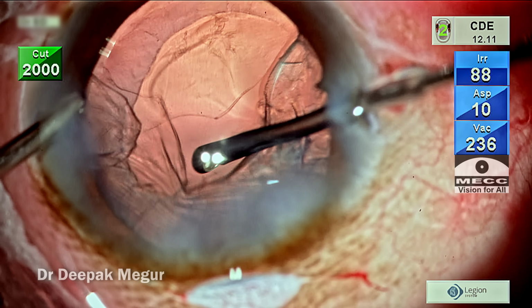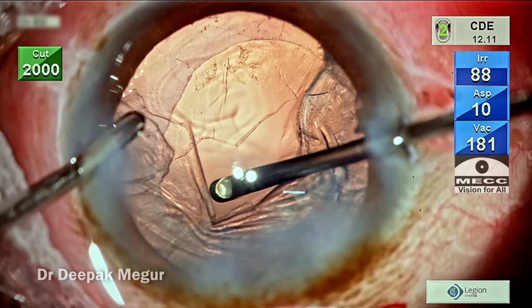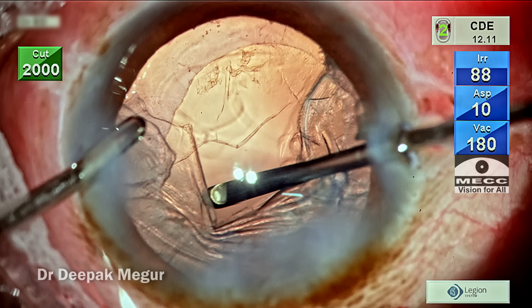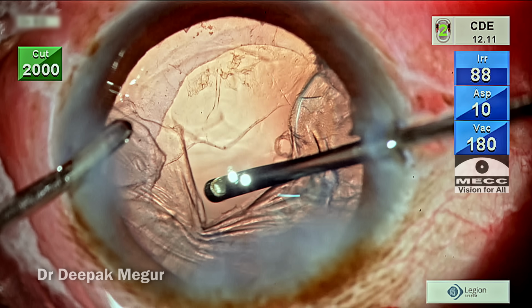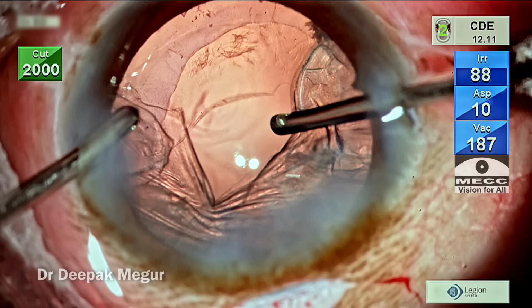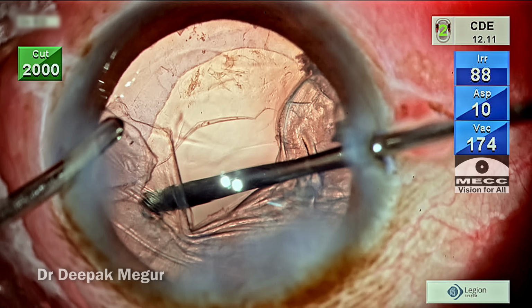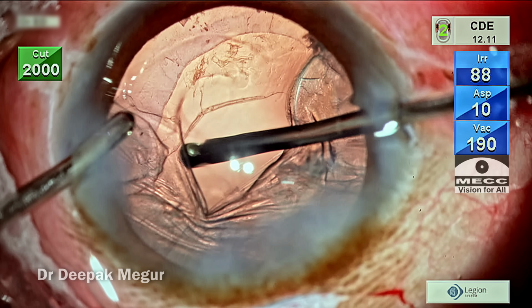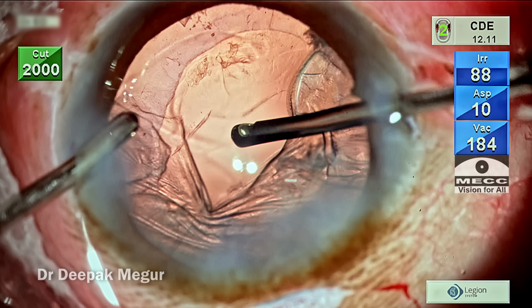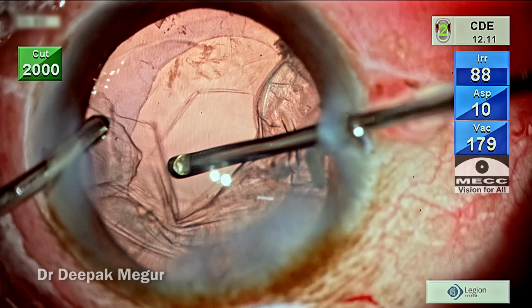Now the port of the vitrector is turned sideways and then anteriorly to cut and aspirate the vitreous which is in front of it. Now I can see that the posterior capsule tear edge is fluttering very freely. Now this is a sign which indicates that there is no vitreous around the posterior capsule tear. If there is vitreous around the posterior capsule tear, it wouldn't flutter because the heavy vitreous would tug at it and prevent the flap from fluttering.